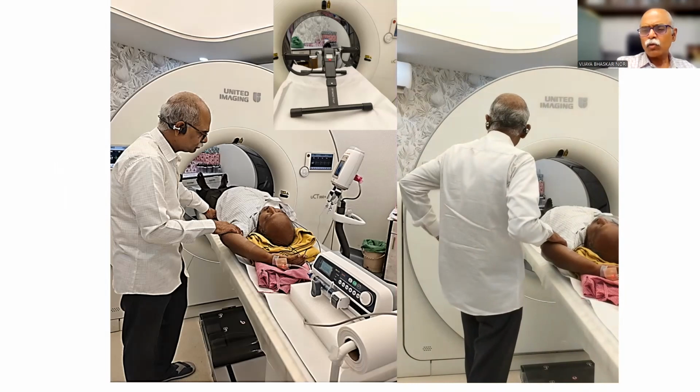Number two, the patient's concentration will be more on doing the limb elevation, and he will try to overcome the somatic complications like flushing, chest pain and chest discomfort. Those are relatively ignored by the patient.